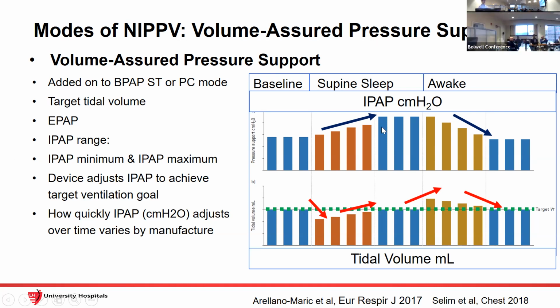That's a great concept. From a practical point of view, the chip that's in the machine is the same chip for everything. It's just programmed within the machine. You've got CPAP, you've got APAP, ASV, you've got this, it's just the outside of the machine.